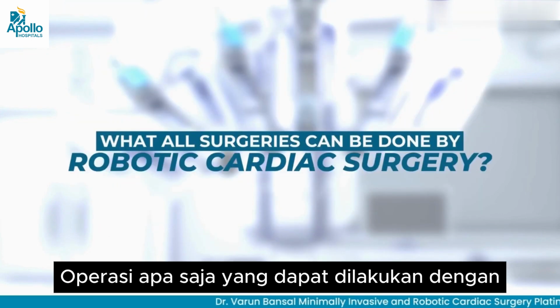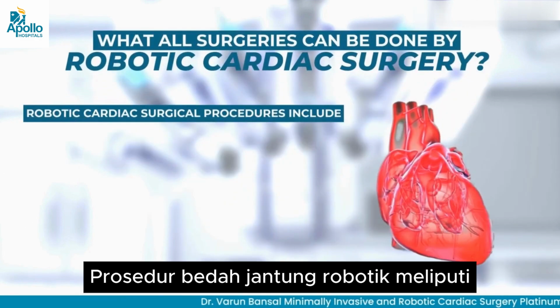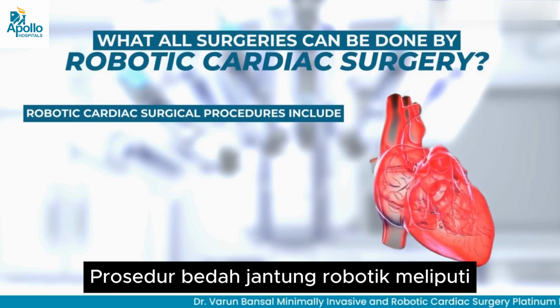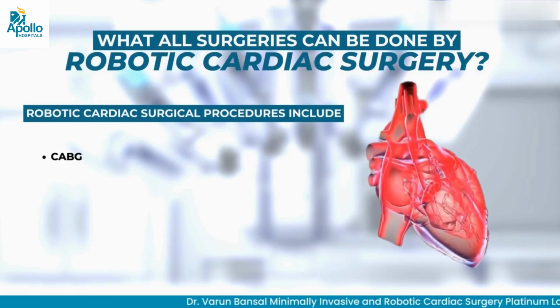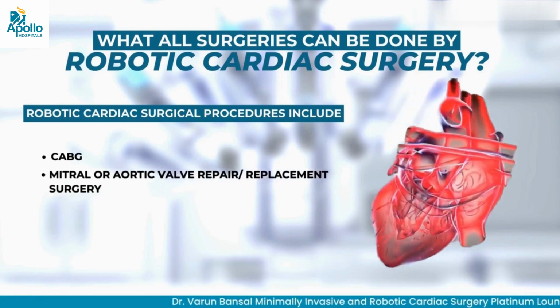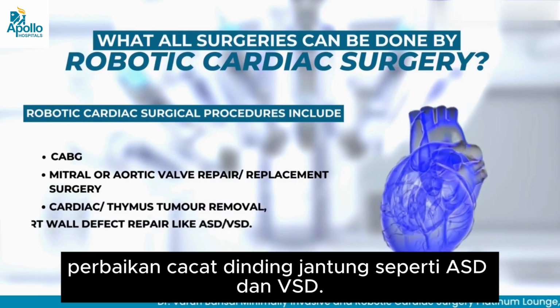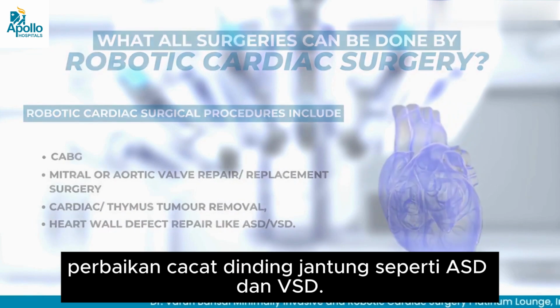What all surgeries can be done by robotic cardiac surgery? Robotic cardiac surgical procedures include CABG, mitral or aortic valve repair and replacement surgery, cardiac and thymus tumor removal, heart wall defect repair like ASD and VSD.